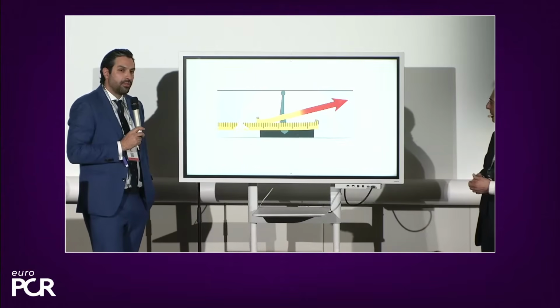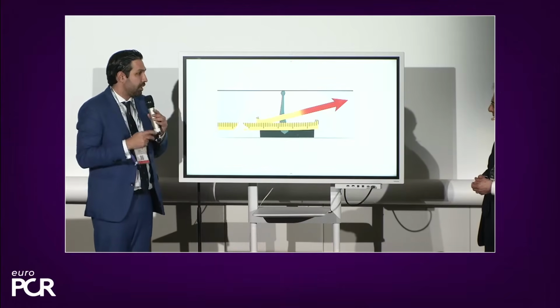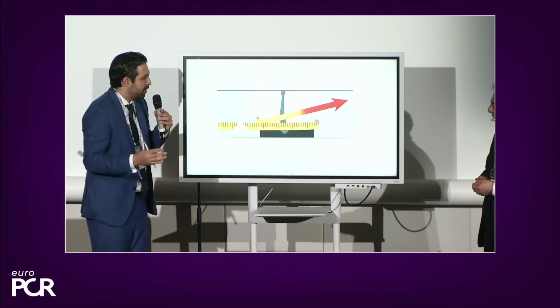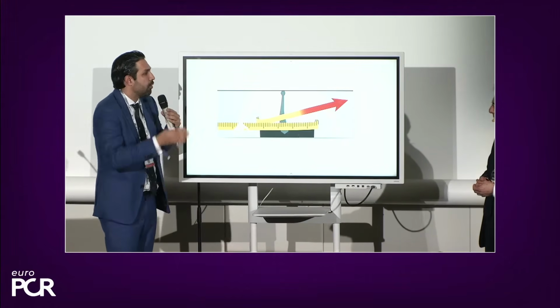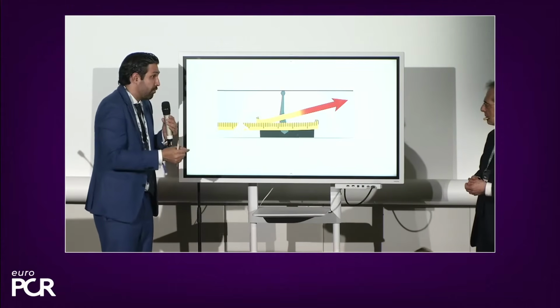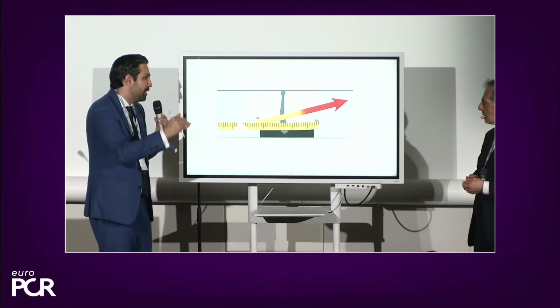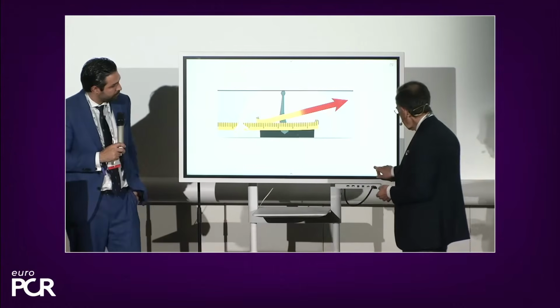Yeah, I think that the on-label limit is 35. We need to understand how these patients behave. Of course, we're pretty sure that below 30, the images will look fantastic. We need to understand a little bit more between 30 and 35 to come up with a number to say, okay, this technology performs in this way, and understand with the intravascular data at hand what is the limit to consider using this technology in the cath lab. Got it.